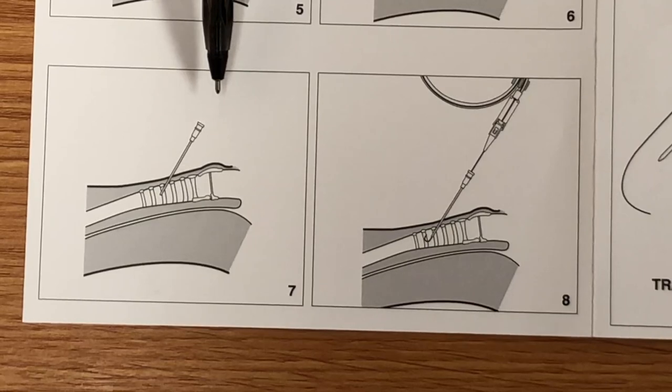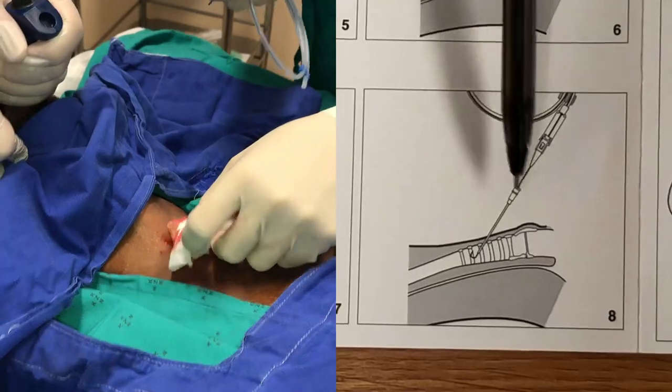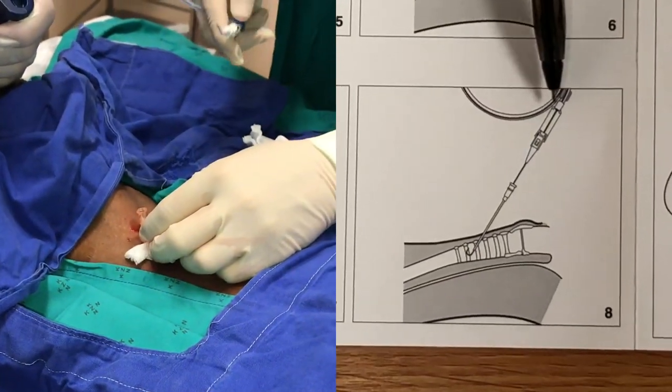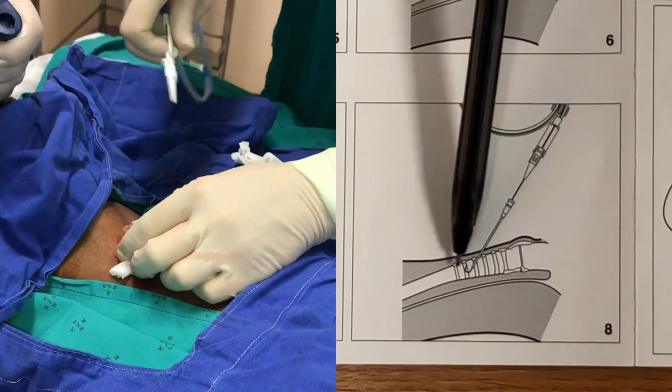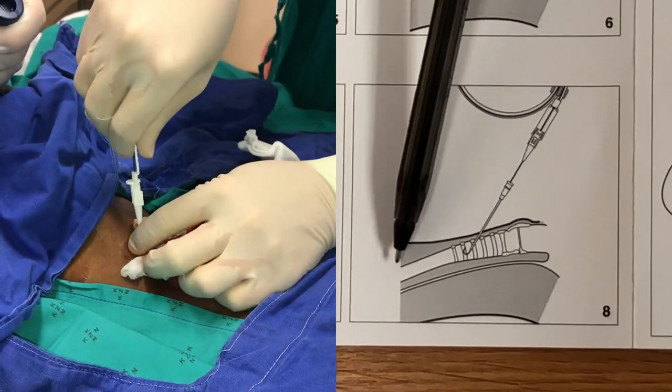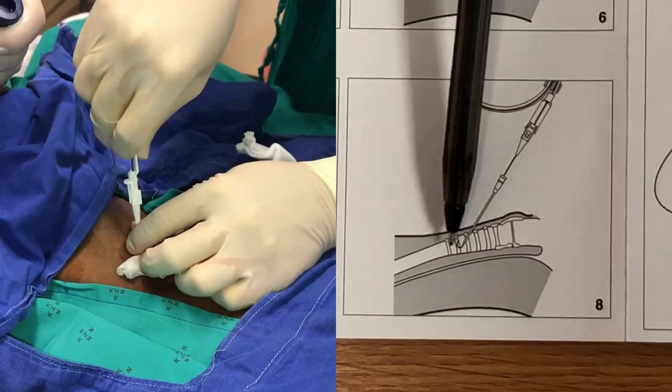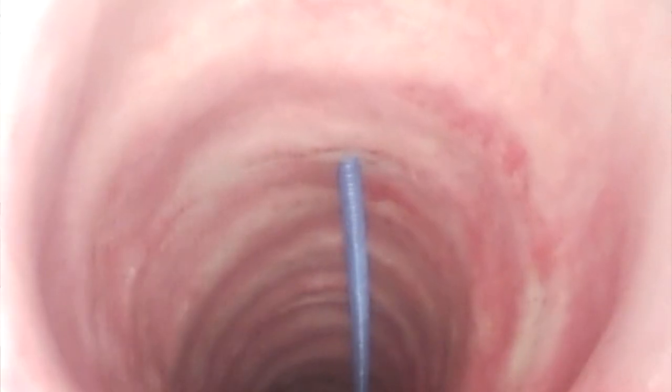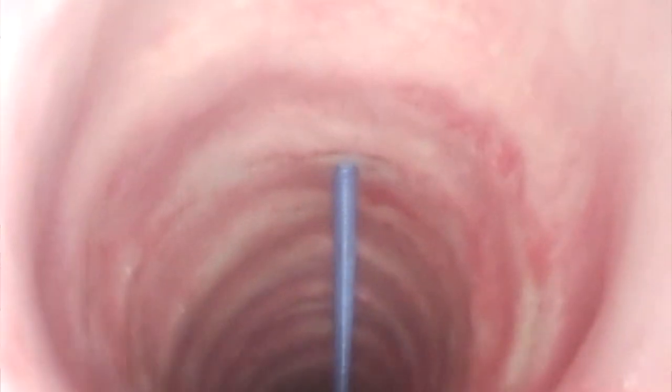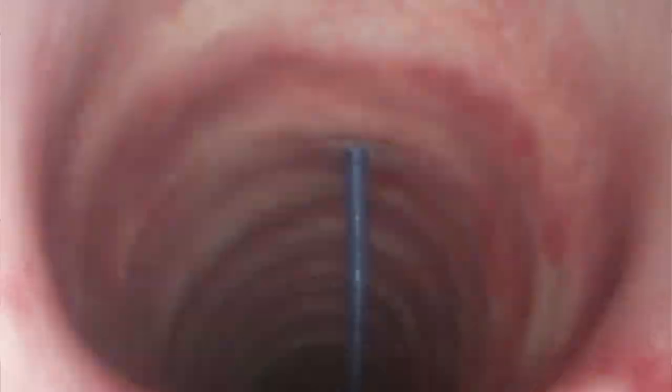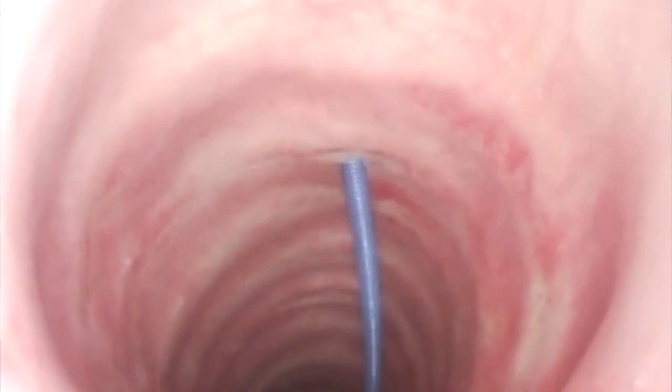The next step is to insert the guide wire through the cannula. It's my practice to gently and slowly insert the guide wire until it just lodges in the bronchus and I can't insert it anymore. If you are concerned about pulmonary hemorrhage don't insert it that deep, but normally this gives you the security that you are again confirming an intratracheal placement.